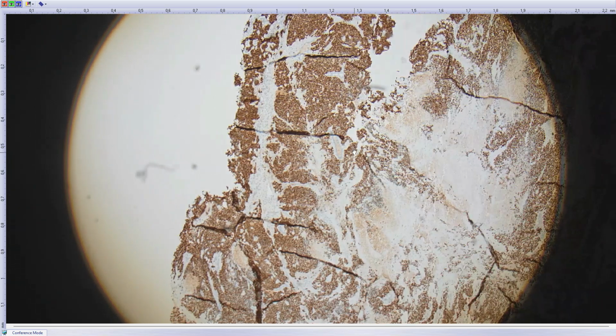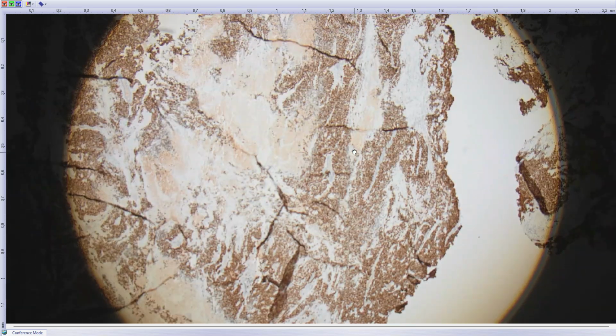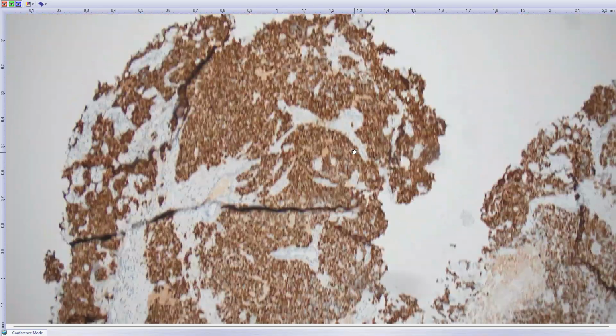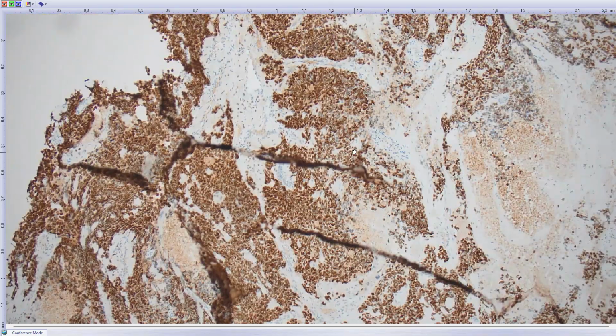So I added MyoD1, myogenin, and you can see that there is probably not a single cell which would be negative here. So again, the lesson for everyone, including me, if you are after rhabdomyosarcoma a lot, don't end with desmin. Always do other markers, especially MyoD1. Sometimes I still forget about this. So alveolar rhabdomyosarcoma, PAX3-FOXO1 fusion.